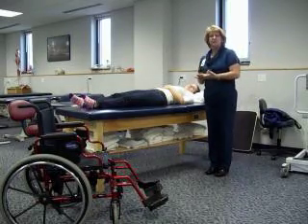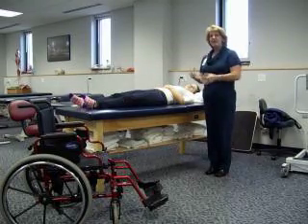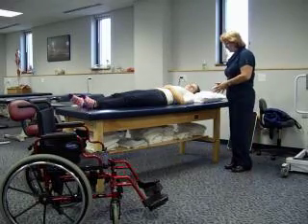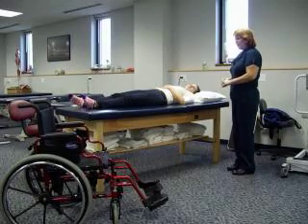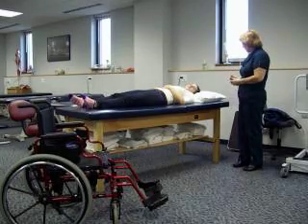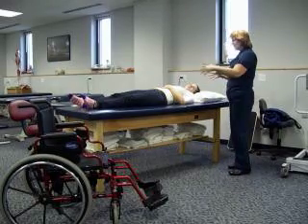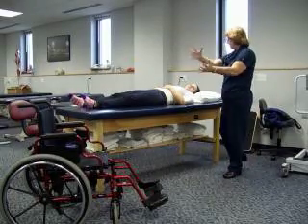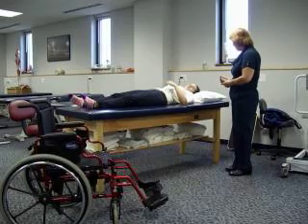If we're using the solid sling, this would be for a patient who is fairly weak, maybe doesn't have good head control, needs a lot of support. My name is BJ, I'm from physical therapy, and we need to take you down to the pool to do your therapy today. I don't have anyone to help me, so I'm going to use this machine to help get you into the chair. I'm going to be putting a sling underneath you, then we're going to lift you up, take you over to the wheelchair, and lower you into the wheelchair. It should be very comfortable. If anything's uncomfortable, be sure to let me know.